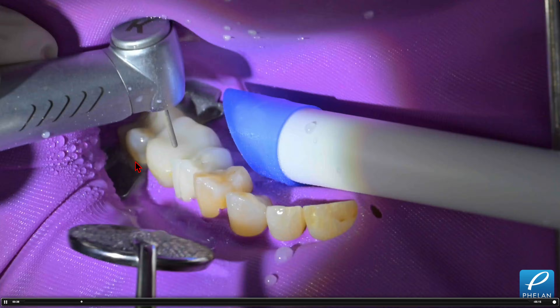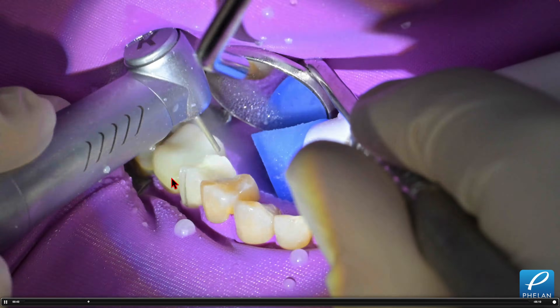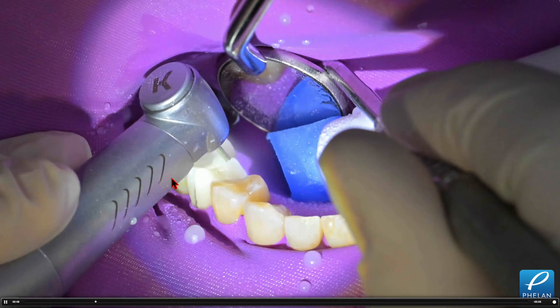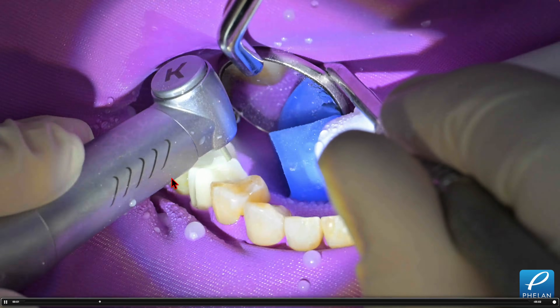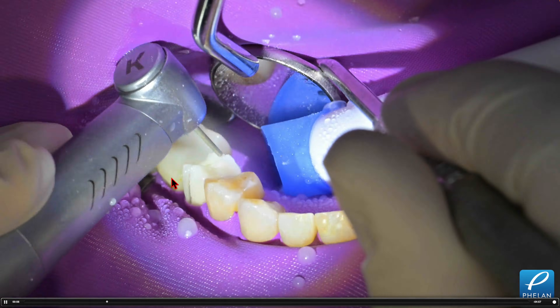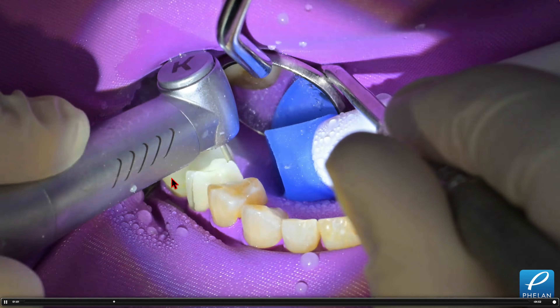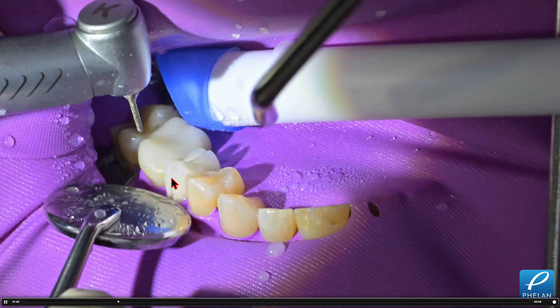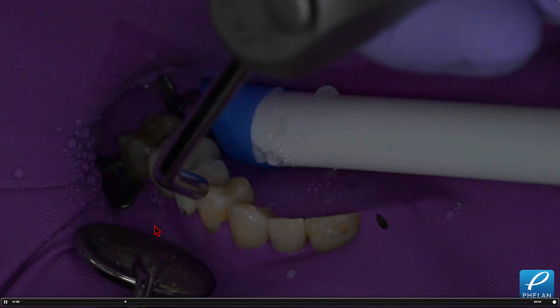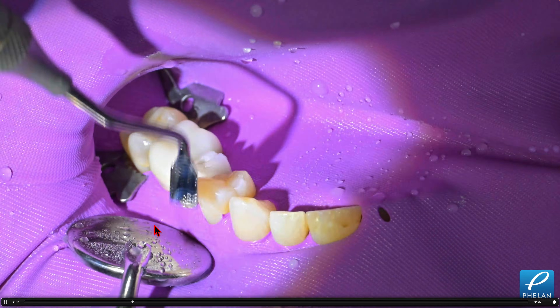We're just splitting the crown. Be careful not to over-prep into the preparation of the tooth, so we're using lots of water and a mirror. I'm not sure what kind of crown this was. I was doing a rehab case this week on a dentist, and we're opening his vertical because he had a lot of anterior tooth wear and end-to-end occlusion. So we're removing the old restorations and I'm carefully sectioning the preparation.